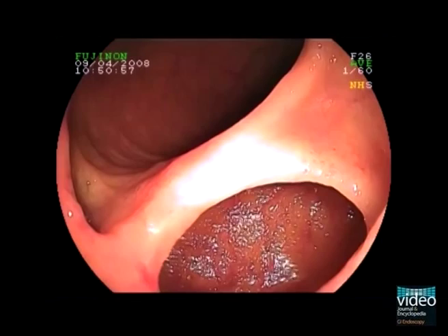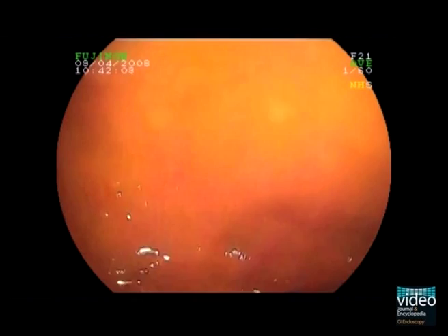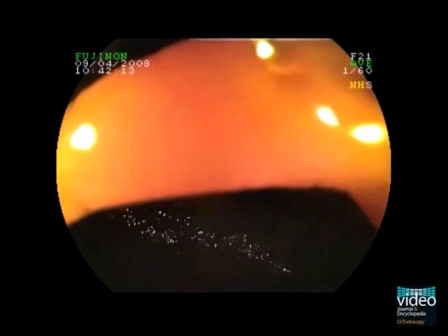The tip of the endoscope has entered the diverticulum without evidence of ulceration. Contrast medium instilled through the working channel shows the diverticulum without filling defects. The presentation of an ulcer opposite the diverticulum is unusual.